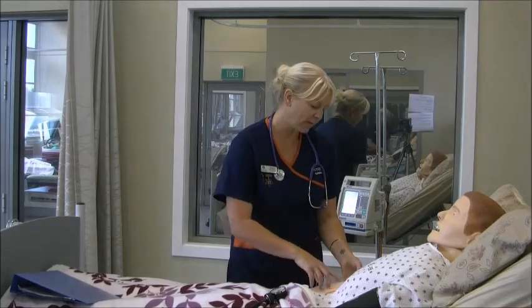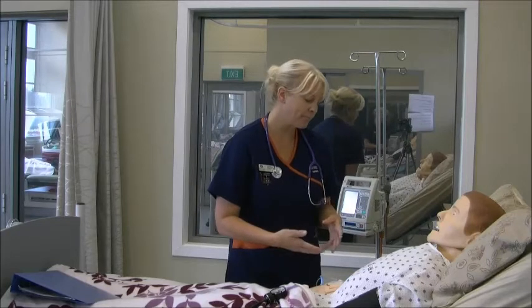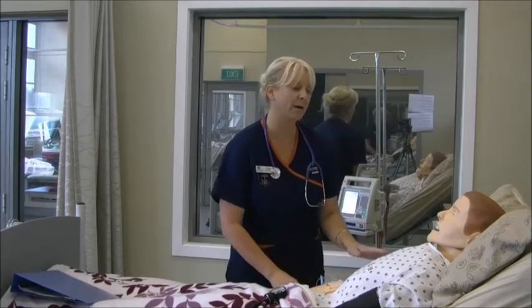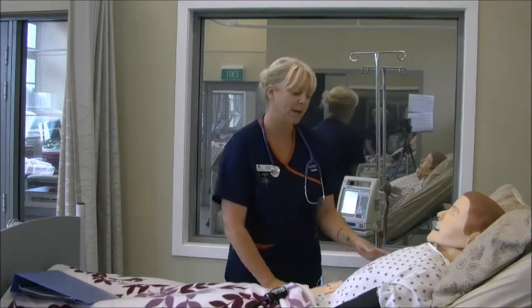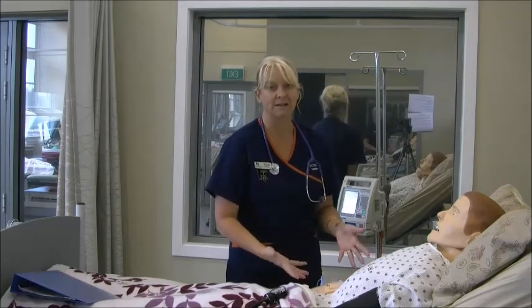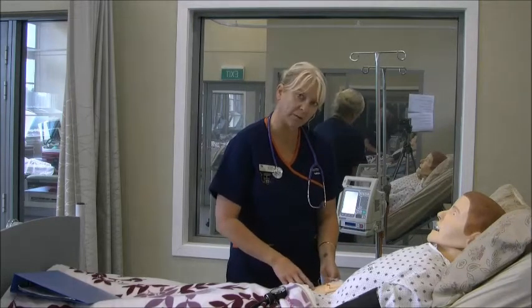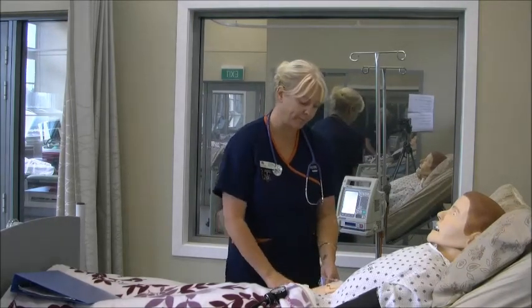So when I'm looking at the site, I'm looking for any redness, pain, swelling, or irritation, or he might say to me that it's really sore. My assessment at this point is that it has none of those things, so his VIP score is 0. So I'm happy to carry on and put the IV fluid up.